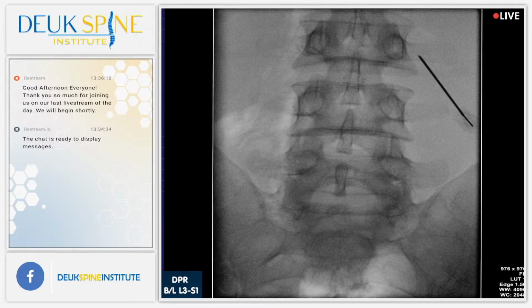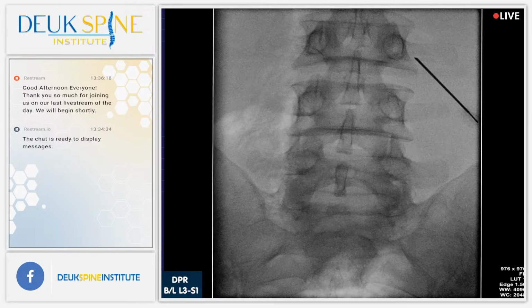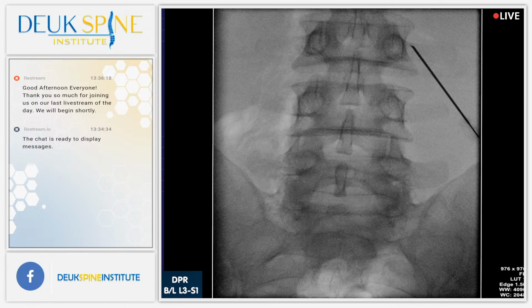It's too low. And it's just sliding right over the top of that TP. And again. That's the perfect spot right there. Had to struggle with that one a little bit, getting in the right spot.